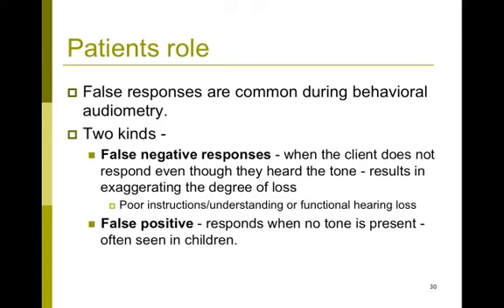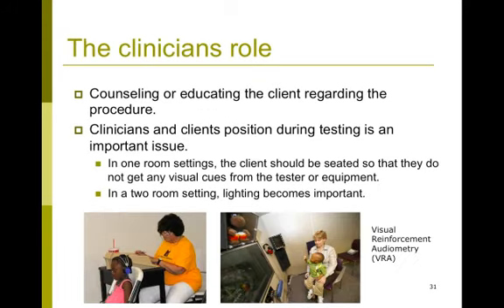You might see that with children who try to please you, or if they've had the wrong notion that it's good behavior to raise their hand or say that they heard the tone. So you need to look out for both these types of false responses. As a clinician, your role is to educate the patient regarding the test procedure.